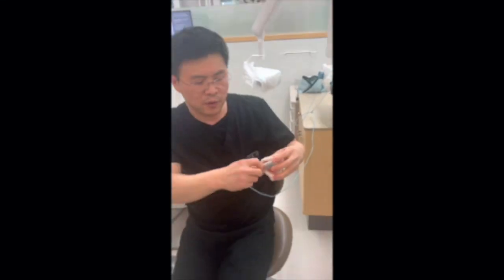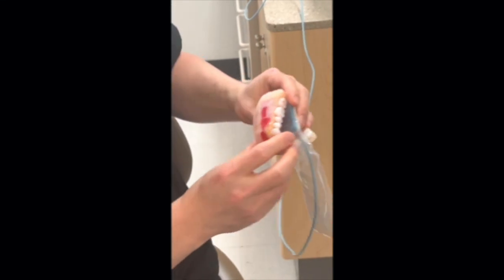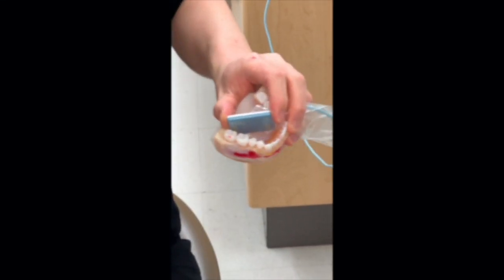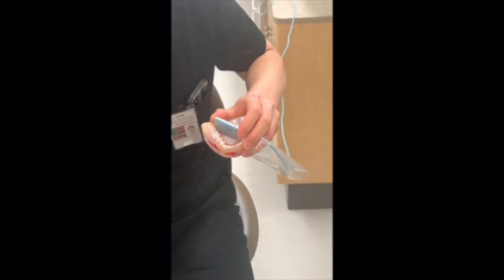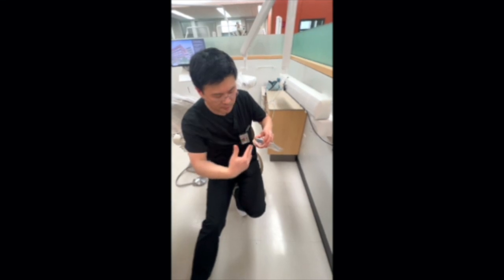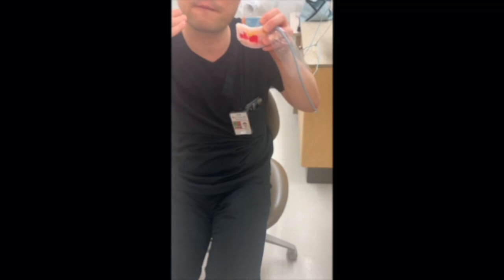Again, once you have it rotated, the X-ray tube angulation won't be straight on, but you'll have a perpendicular access to the sensor, which is almost seemingly from the front view, like you're going at the canine.